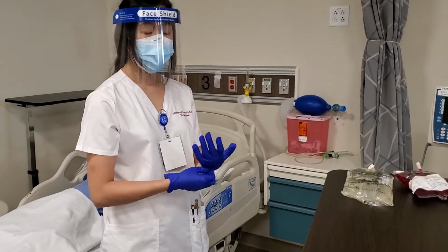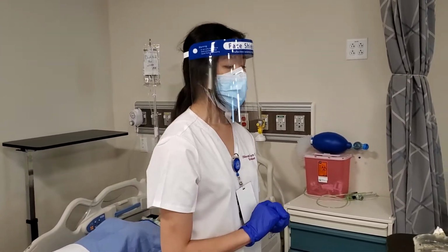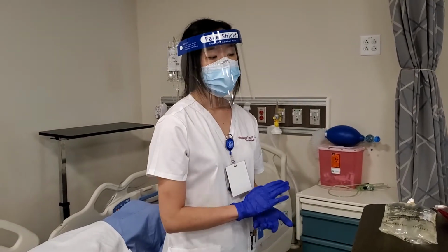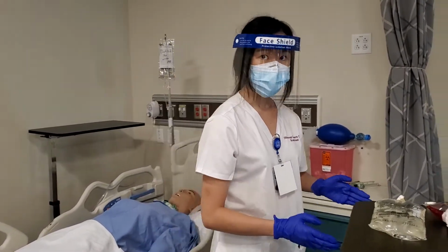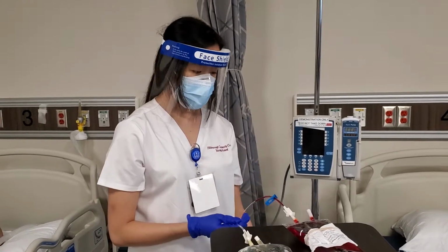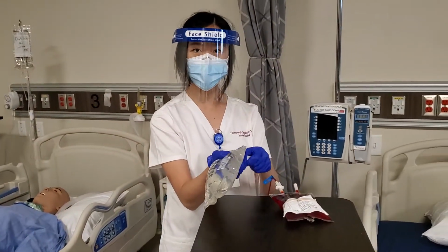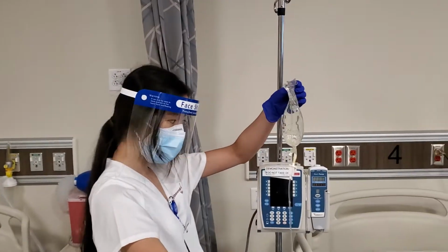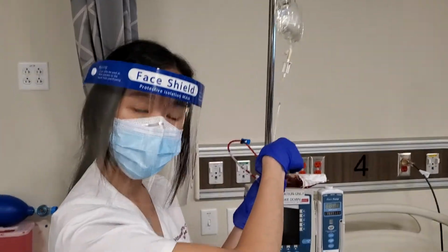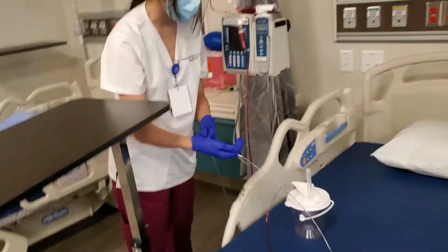Okay. Now I will perform vital signs on my patients to gain baseline vital signs, and then I will ensure that there is a 20 gauge IV access or larger. And then now I will prime my IV tubing. So first I will get my saline bag. I will ensure that this is clamped first, and then I will spike my bag and hang it up. And then I will unclamp the tubing, and then I will unclamp this tube and make sure that the whole line is primed and that there are no air bubbles.